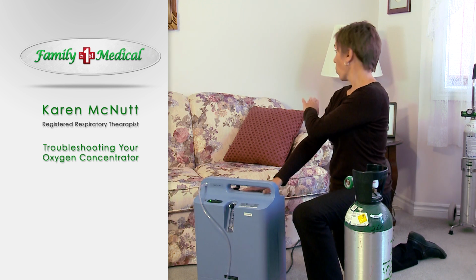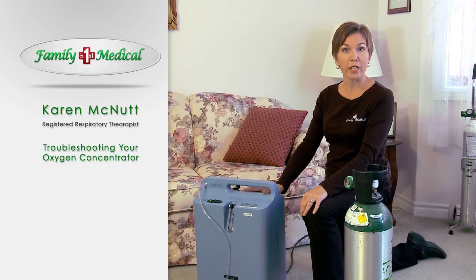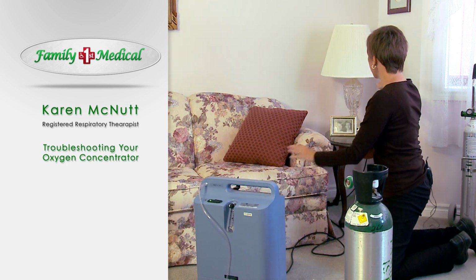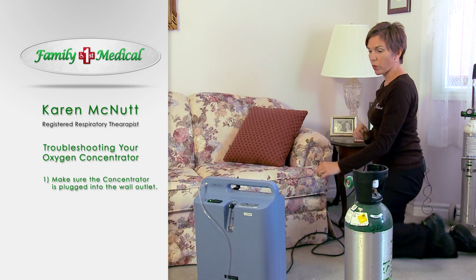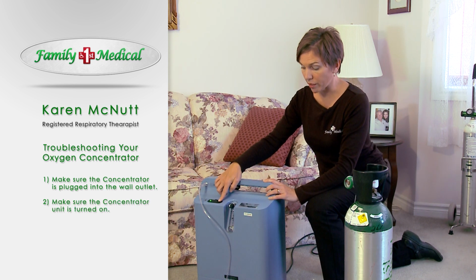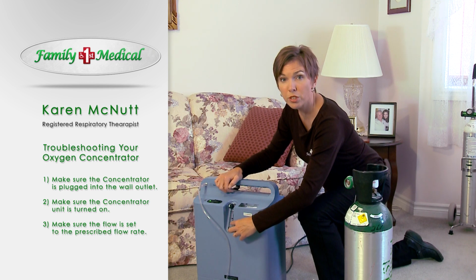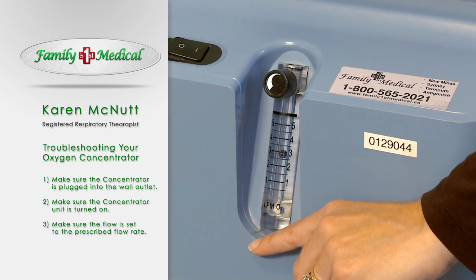We're going to start at the wall outlet and trace our way from the wall all the way to the oxygen patient. So let's start at the wall. First, we're going to make sure that the concentrator is plugged into the outlet. We next then want to come to the unit and make sure that the unit's turned on. Third, we'll want to check that the flow is set to your prescribed flow rate. In this case, it's at 3 liters per minute.